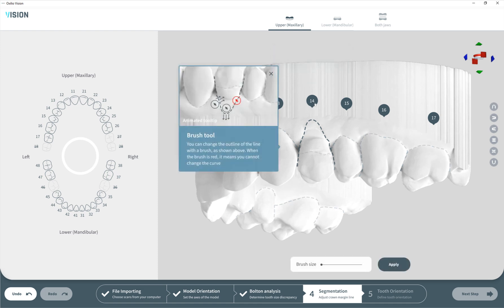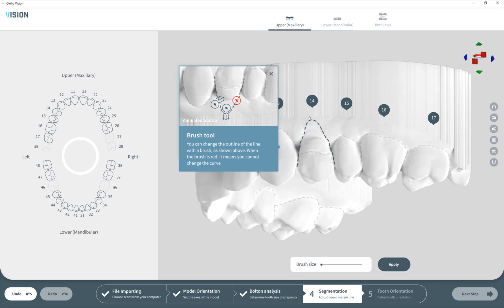We can select the tooth - for example tooth number 14 - and edit this curve. You select the tooth and can edit only the segmentation line for this particular tooth. You'll have a circle around your cursor and by clicking, you can shift and move this curve nicely from inside and outside. When you're hovering your mouse over the line it becomes red, meaning you cannot do anything with that.